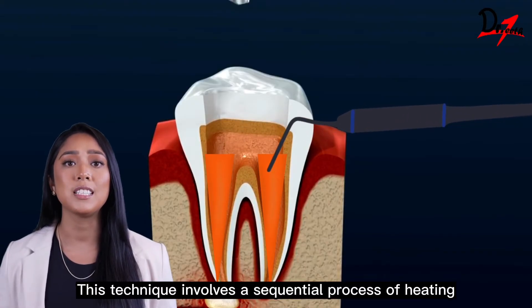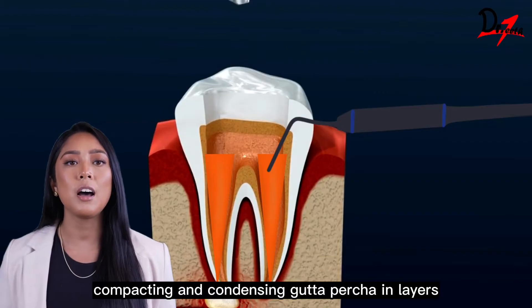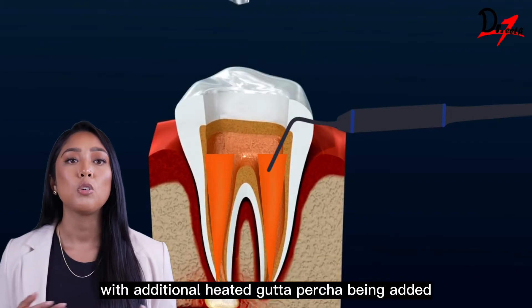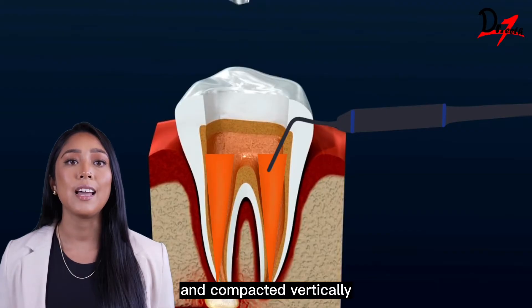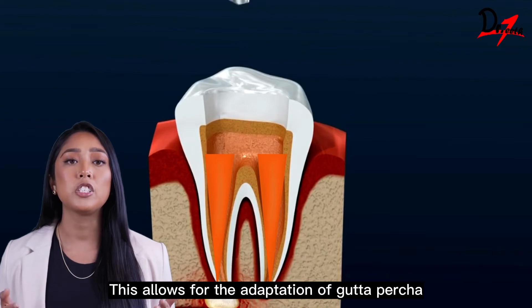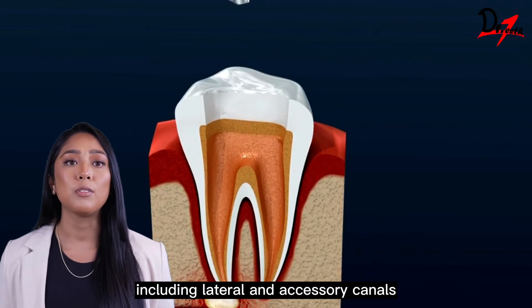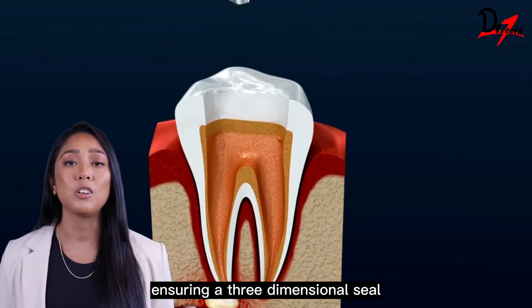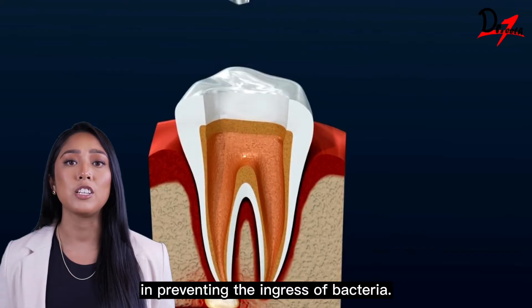This technique involves a sequential process of heating, compacting, and condensing gutta percha in layers, with additional heated gutta percha being added and compacted vertically until the obturation reaches the canal orifice. This allows for the adaptation of gutta percha to the canal walls, including lateral and accessory canals, ensuring a three-dimensional seal and preventing the ingress of bacteria.